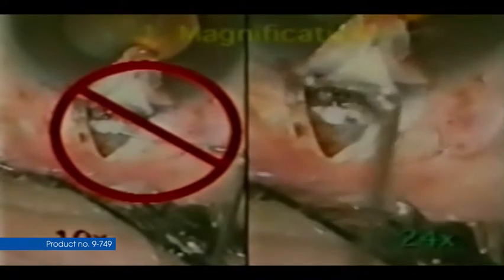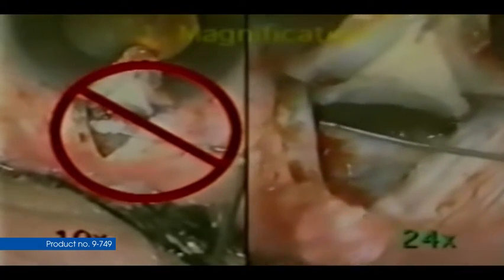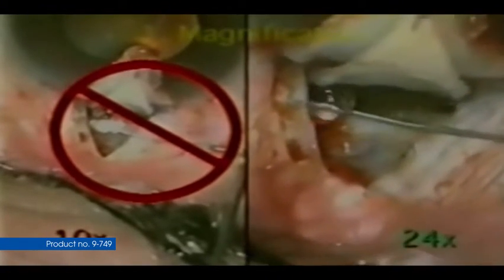Step 1: Working at high power is critical. We are used to working between 8 to 10 times magnification. Most of this procedure should be performed at 20 to 25 times magnification. It is said that we are limited by what we can see, but more correctly, by what we cannot see.